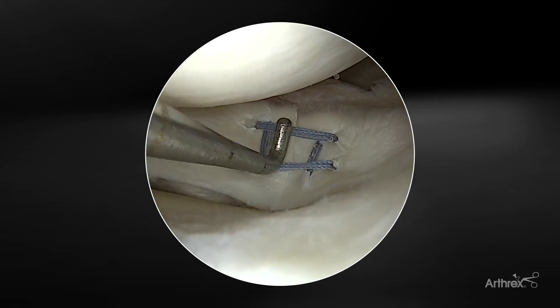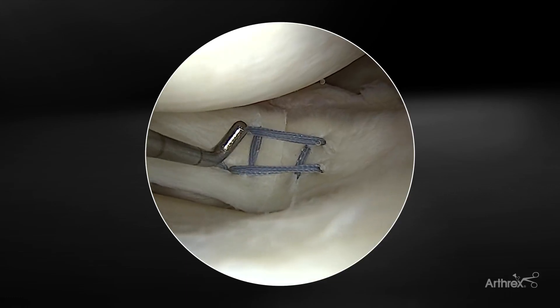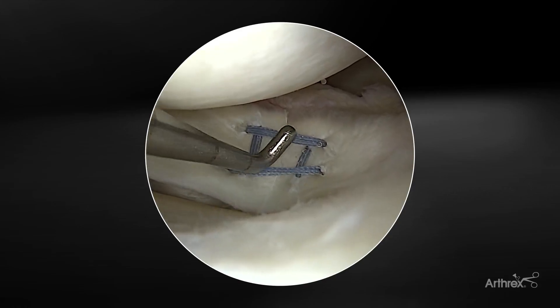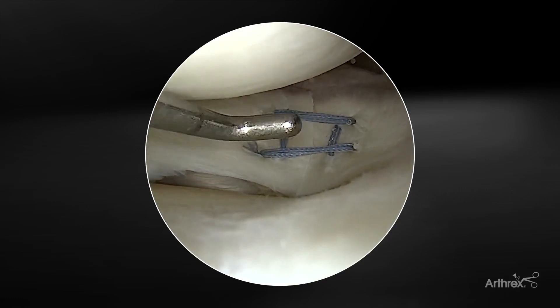The ripstop stitches are critical — if you're just relying on horizontal mattresses, you may easily get that rip-through. This is a really nice construct for these very complex and challenging tears, which fortunately are not very common, but really present the sports surgeon some of their most challenging cases.